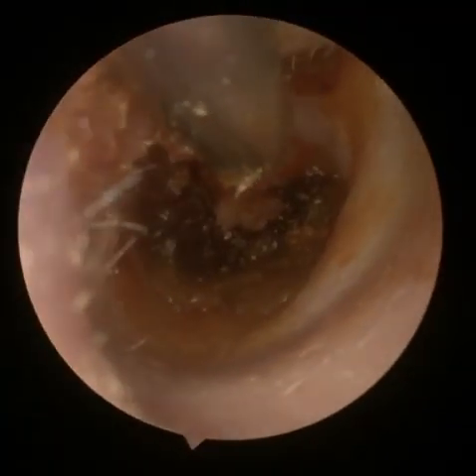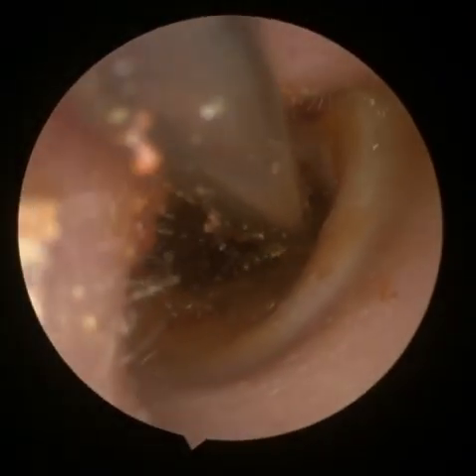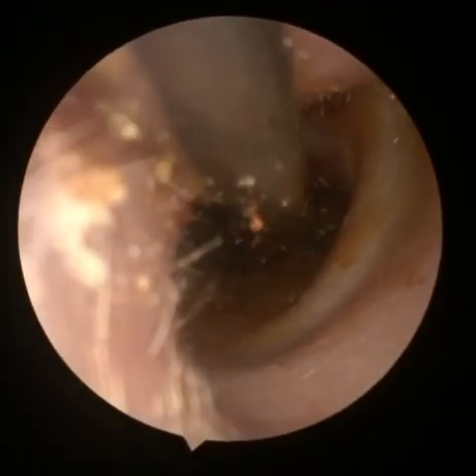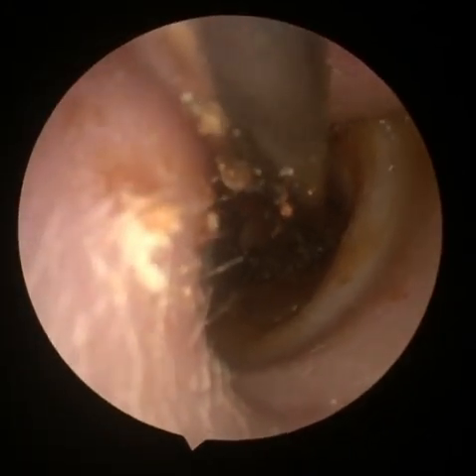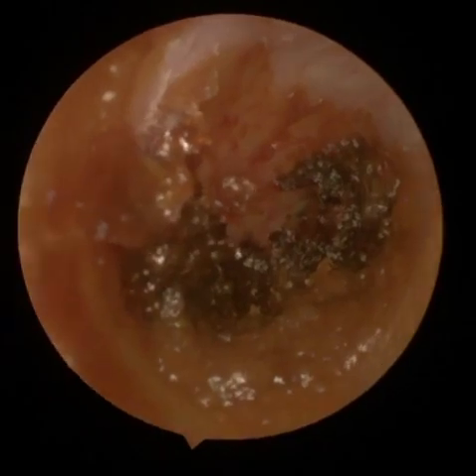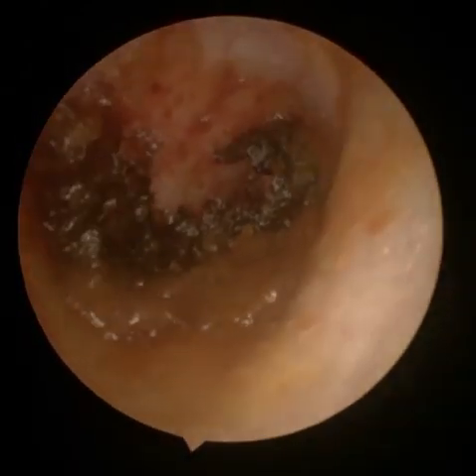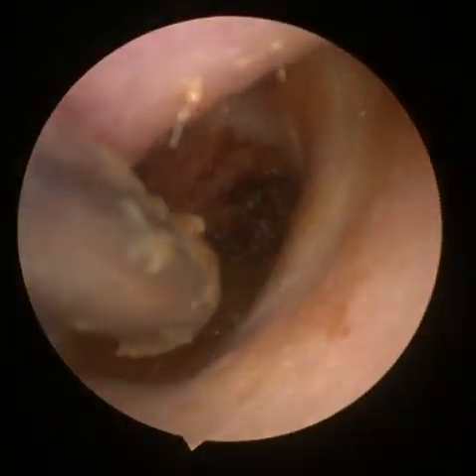Of course I'm being incredibly careful — you always have to be careful with the patient, always advise them what's going on and counsel them as you're in their ear with the suction cannula. It's a very sensitive part of the ear, so you'll find there might be the odd twitch from time to time. Just keep the patient nice and calm and settled. I've just left the cavity for a second to give the patient a break, and I'm back in again just trying to get my view sorted so I can remove that wax effectively.